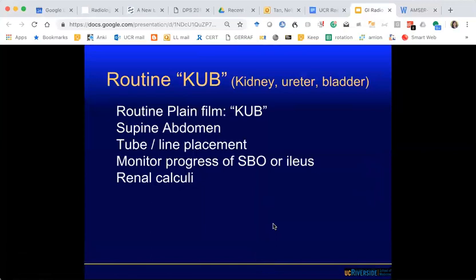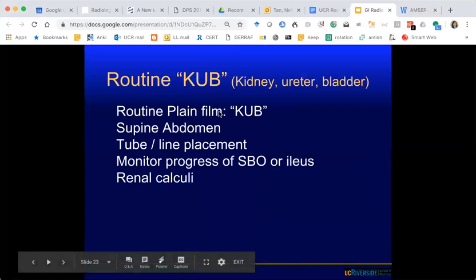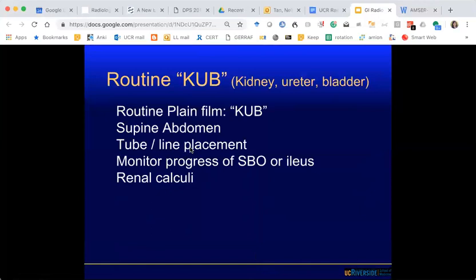Routine KUB is a plain radiograph, typically acquired with the patient in supine position. This is the bread and butter for looking at lines and tubes, SBO, ileus, and renal stones. But it's just a screener — if it's a negative KUB and you still have high clinical suspicion, you shouldn't stop at the radiograph and need something more.